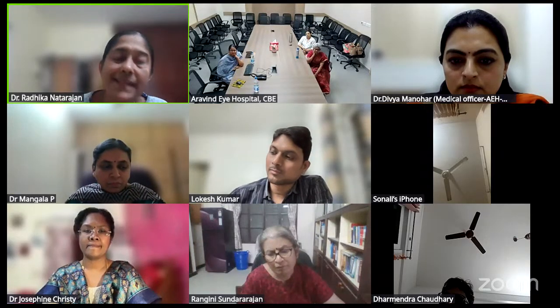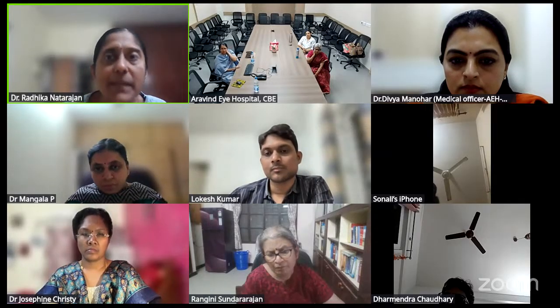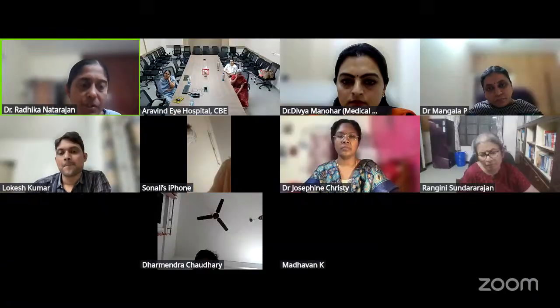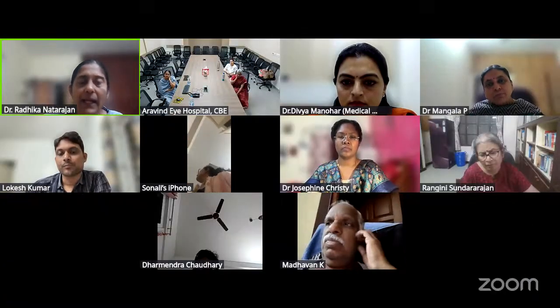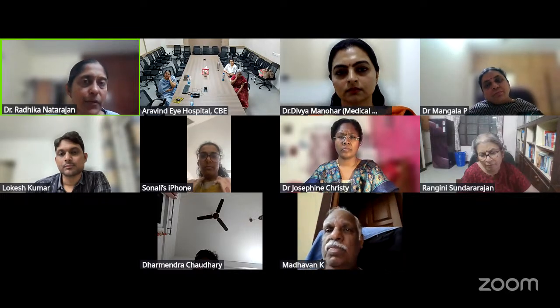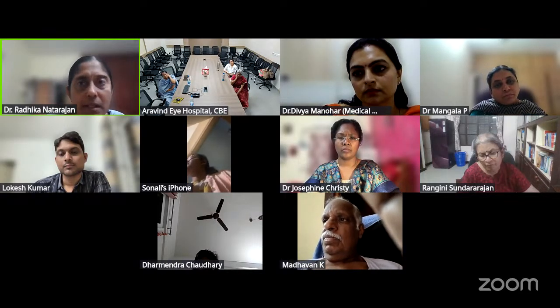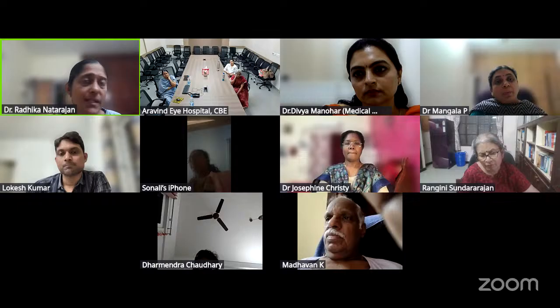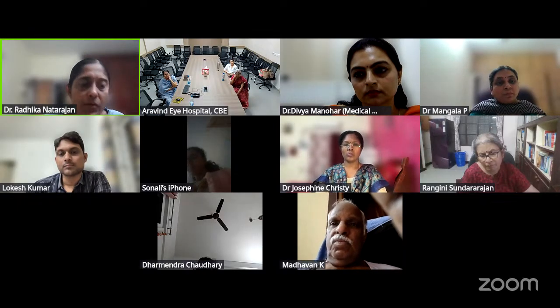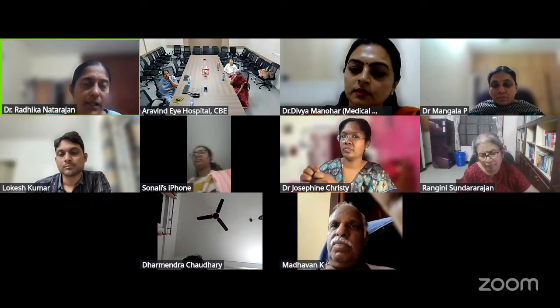By the same token, in the normal population also, asymmetric bow tie and symmetric bow tie can be seen. So that alone is not a criterion. Like she rightly pointed out, the posterior elevation should be a guideline. And I don't know how many people have noticed this. It's not a sign or anything, but many young keratoconic patients also have a single cortical spoke cataract. I'm not saying it's diagnostic, but if you see that, you can add it to your list of diagnosing points. So these are some features which I thought I should mention.